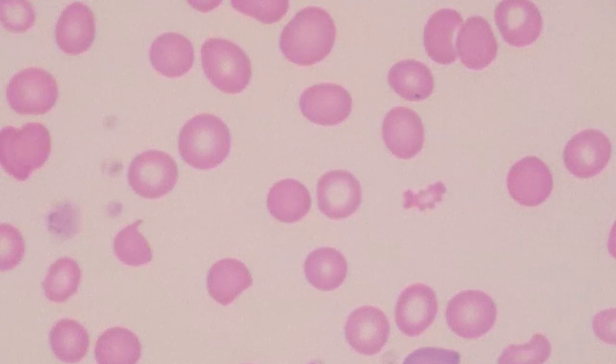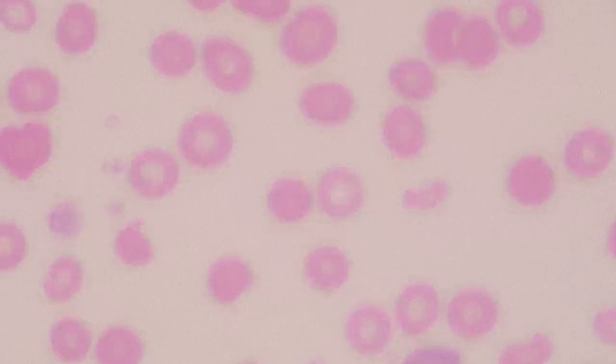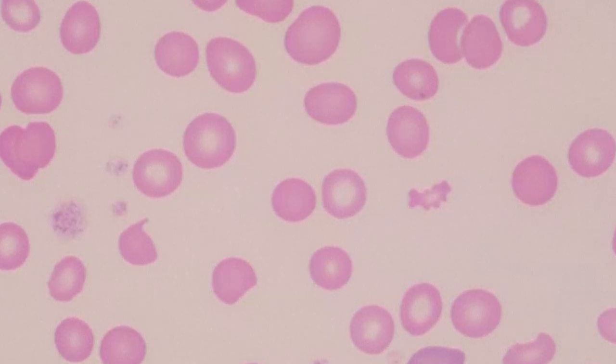Okay, so in the center here we have a few red cells that have an increased central pallor. So in the very center, you have 2 red cells right next to each other. One of them has almost no central pallor, and then the one to the right definitely has an increased central pallor. And what we would look at in the analyzer printout is the MCHC, the mean corpuscular hemoglobin concentration. And normal for that is usually 32 to 36 grams per deciliter, or it can be reported out as 32 to 36%.